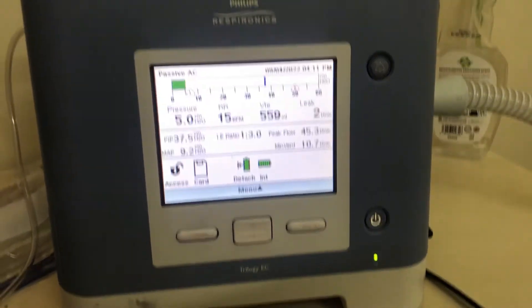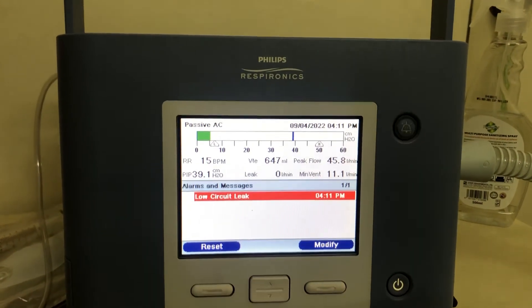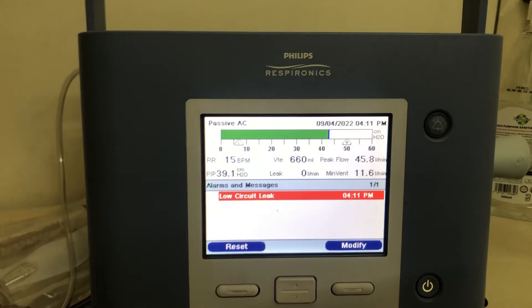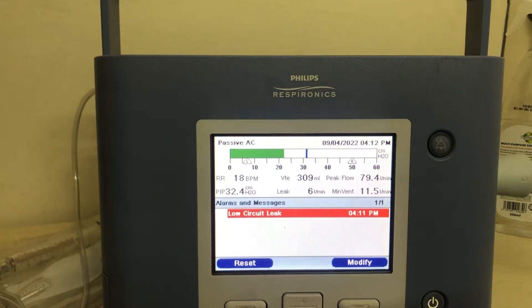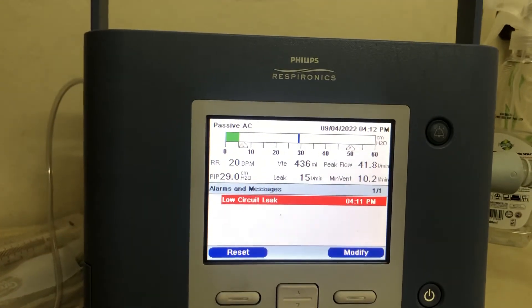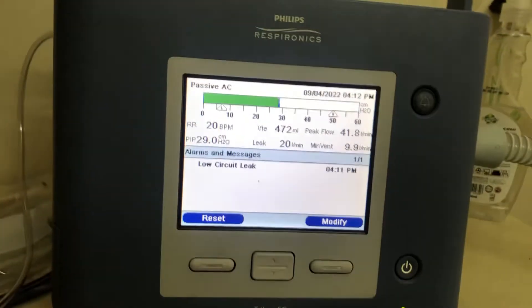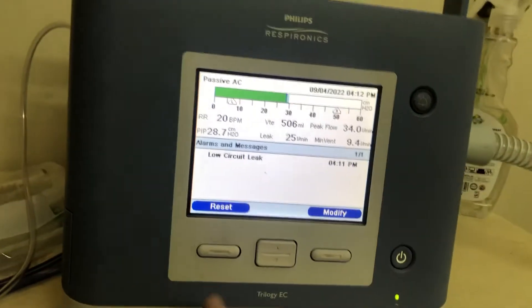The machine will recognize this, and in about a minute it will alarm. There we go — low circuit leak — we're flashing. When I remove the obstruction and the circuit leak comes back, the alarm should stop, although the alert will stay there. We're no longer flashing; it's just showing as a former alarm. You can just hit reset to get rid of that.